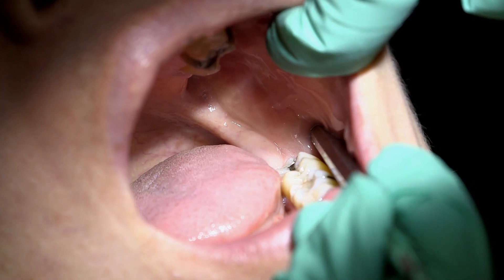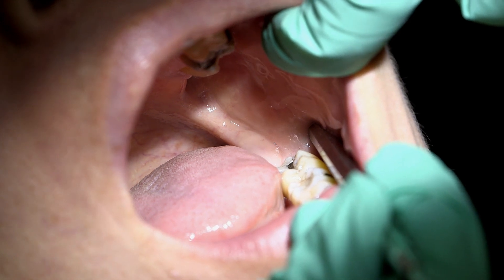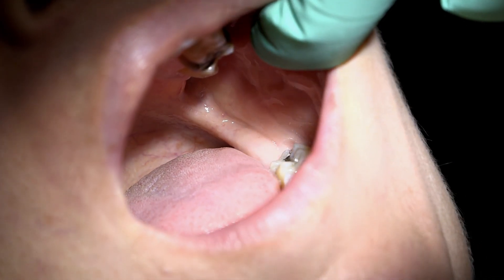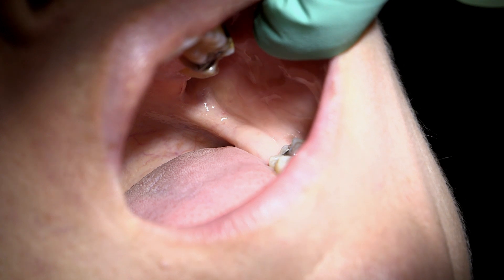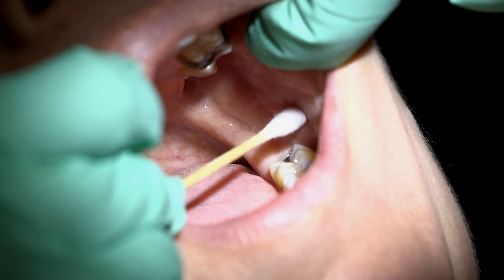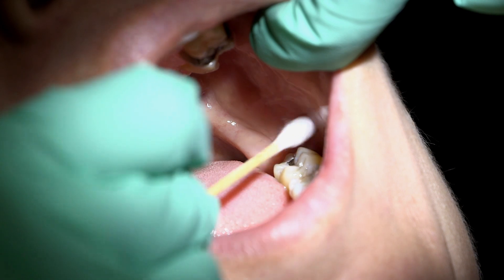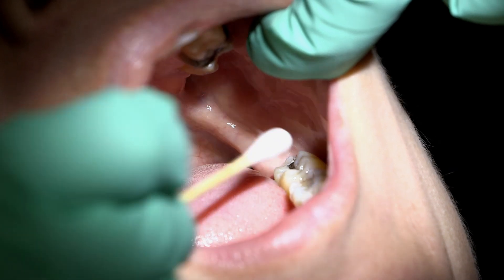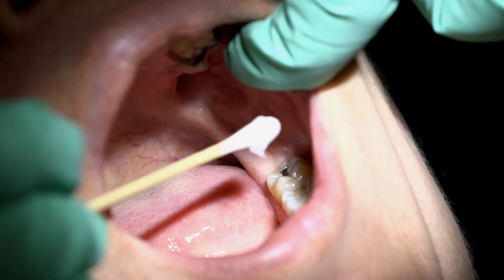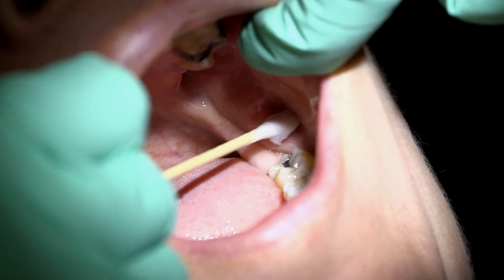The barrel of the syringe should be parallel to the occlusal plane on the side of the injection. Before we administer the local anaesthetic, we need to apply the topical anaesthetic. So first we will dry the tissues, and then we will apply the topical for 1-2 minutes.